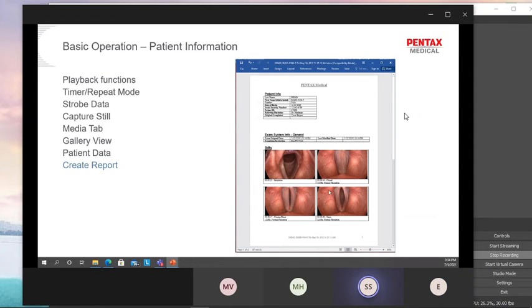Whichever pictures are inside that exam will be put below as the stills. So there's no typing needed. They just need to pull it out, and all the information will be there. Whatever they have done during the case, they don't need to redo it again while doing the report. So this effectively will save them a lot of time.